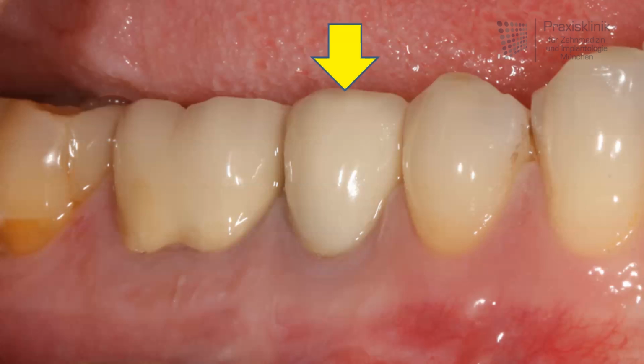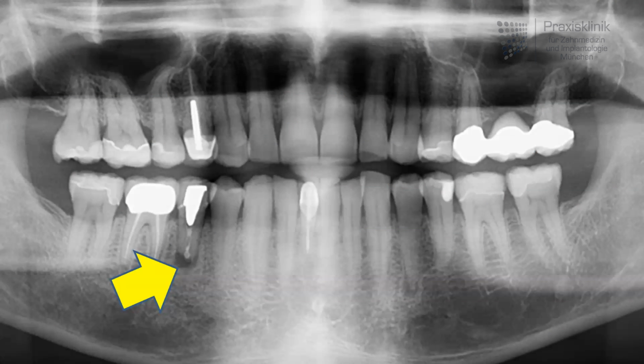You can see here the lower jaw right, and in the lower jaw right, indicated by the yellow arrow, the fifth tooth on that side, which needs to be taken out because of an apical inflammation, again indicated by a yellow arrow. The patient has as well two more inflammations, as you can see in a second, shown by two small blue arrows, which we have dealt with in the same operative appointment.